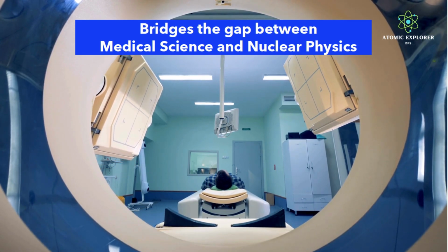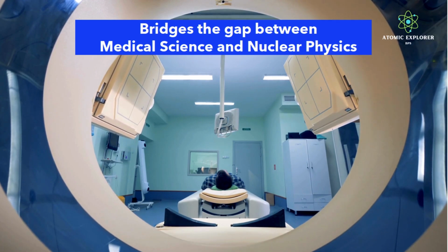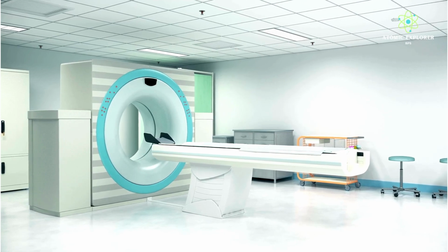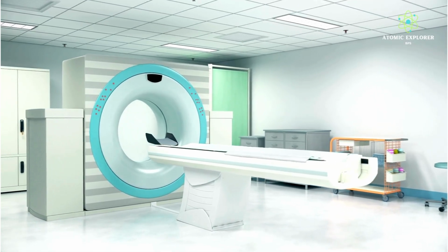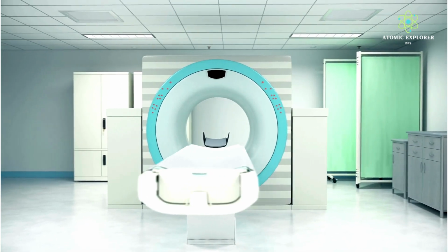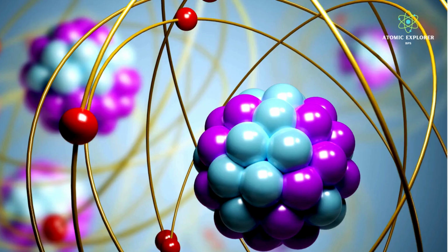A PET scan is a powerful imaging technique primarily used in medical diagnostics. It allows doctors to observe metabolic processes in the body by detecting pairs of gamma radiations emitted indirectly by a positron emitting radionuclide, commonly known as tracer.